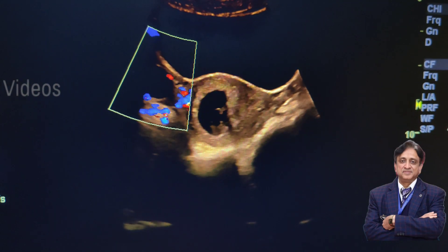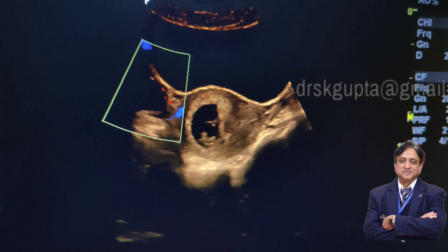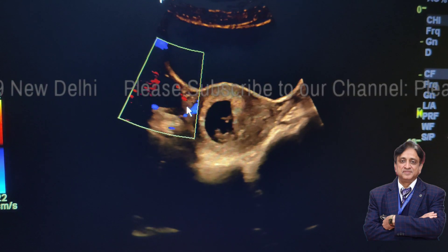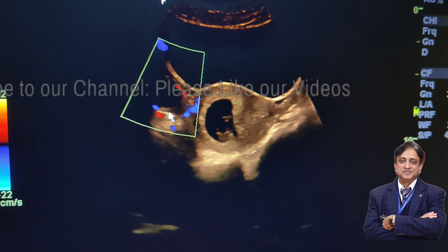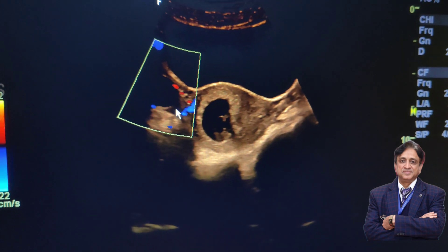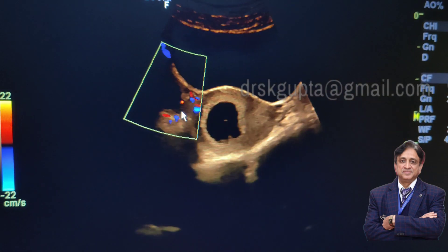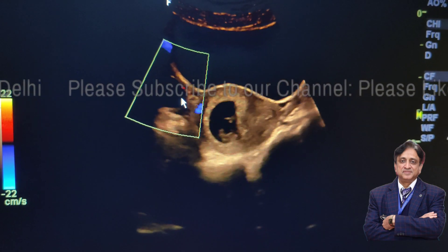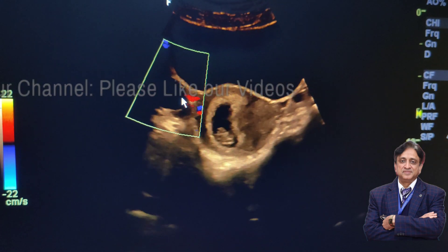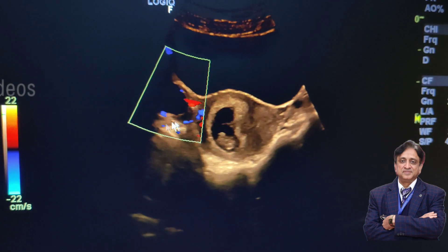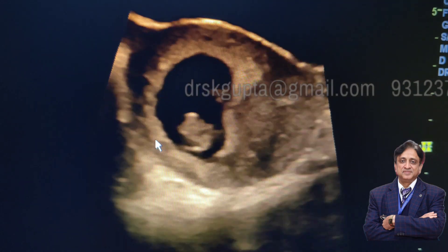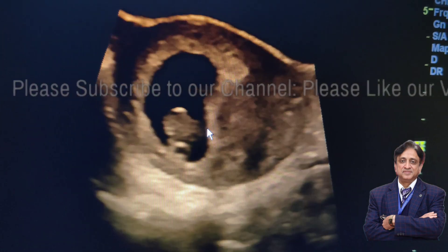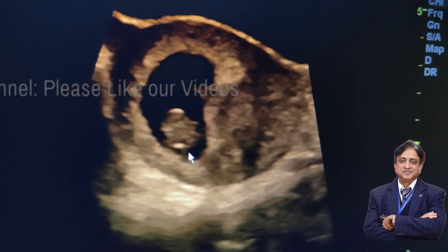Once you have seen the fetal pole, the yolk sac and measured the heart rate, do not forget to look for the ovaries. Here in the right ovary you can see there is a cystic structure which is surrounded by a ring of fire. Sometimes the ring of fire may not be visible very well, because for a ring of fire to be seen in the corpus luteal cyst a good Doppler is required. This is the corpus luteal cyst. The corpus luteal cyst can be present in either ovary but it is always on one side — the side from where the ovum has come out. You can also see that the chorionic reaction is good and regular, all around the gestational sac, indicating a healthy pregnancy with a regular sac shape.